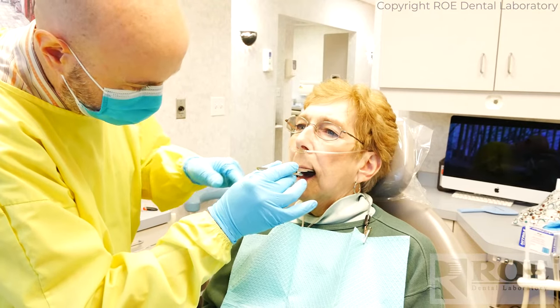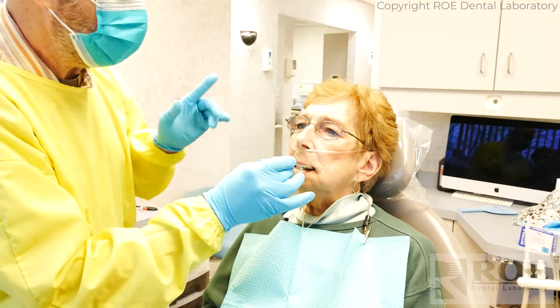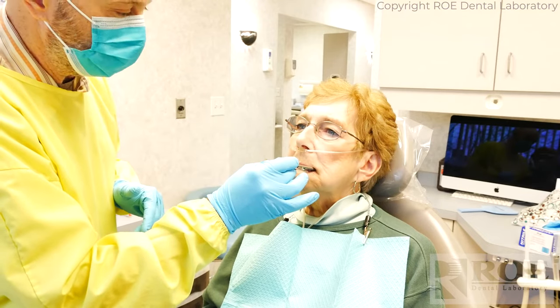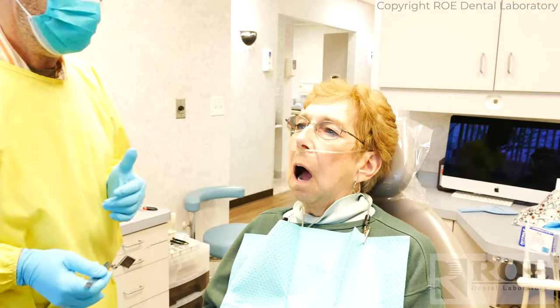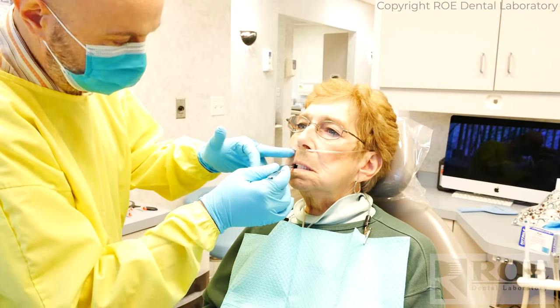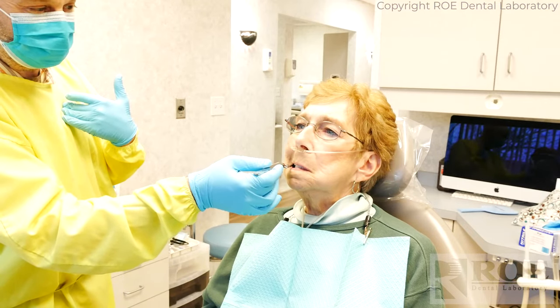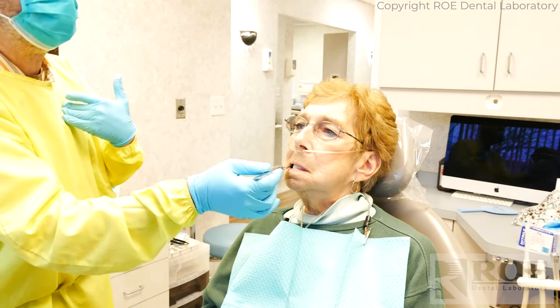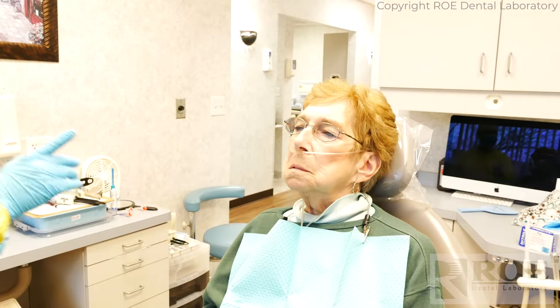Go ahead and bite down. That's right — now you're forward. Perfect. Now go left and right with your lower jaw. She did it great. You can let go, thank you. Nice job. Go ahead and bite again like you normally would — you did it correctly — but towards me this time. A little bit more, keep moving those teeth. There you go. Nice job, you can let go.